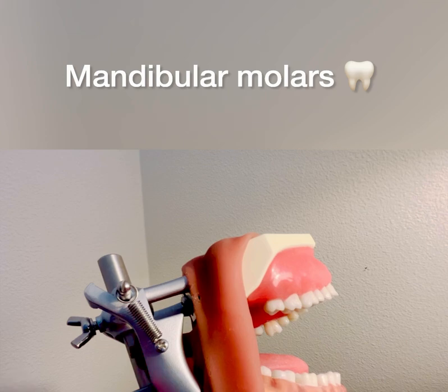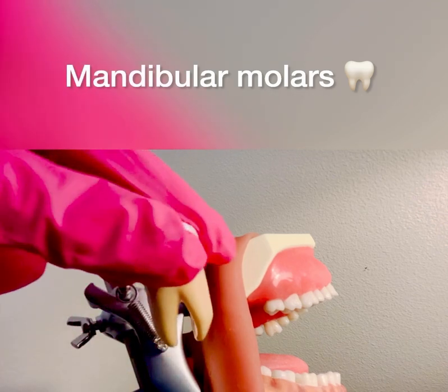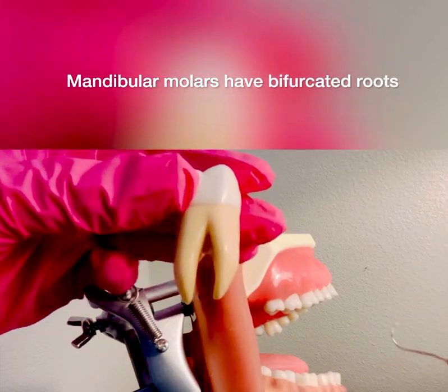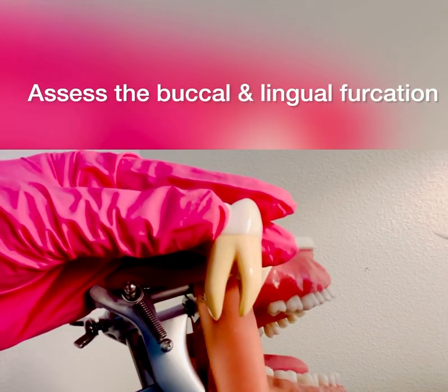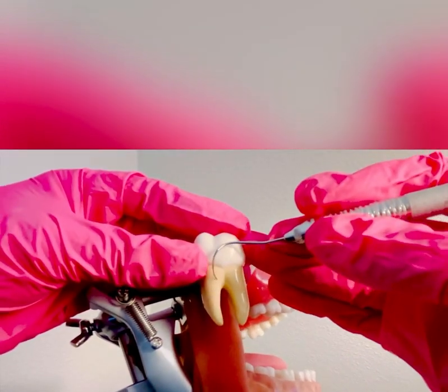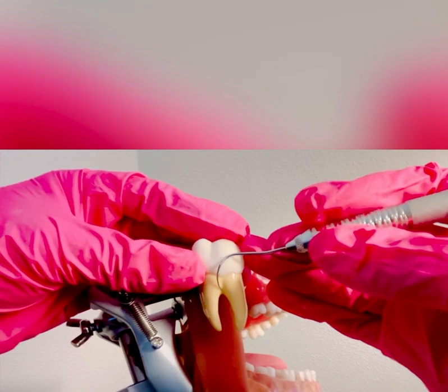For mandibular molars, you do have a bifurcated root, so you would just assess the buccal furcation and the lingual furcation involvement. You would start from the distal line angle, use a little sweeping walking stroke, and assess right into the furcation involvement. On the buccal side — and assuming this is the lingual — you would flip your instrument and assess the lingual furcation.